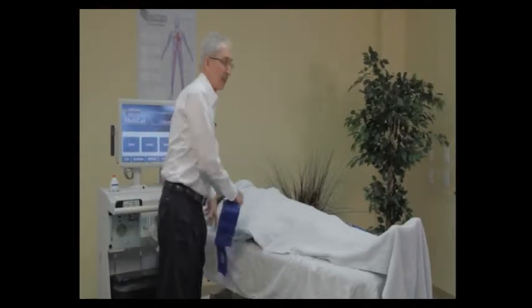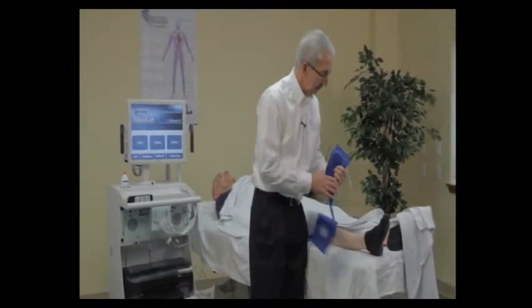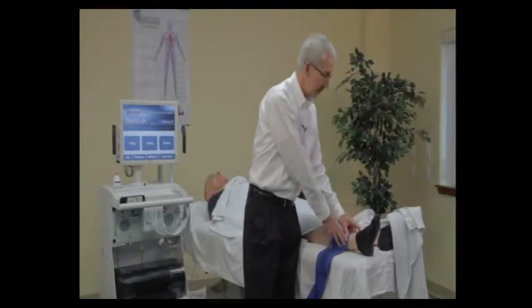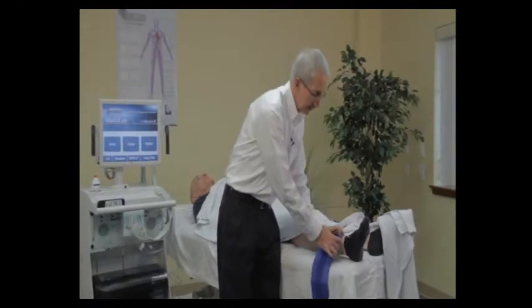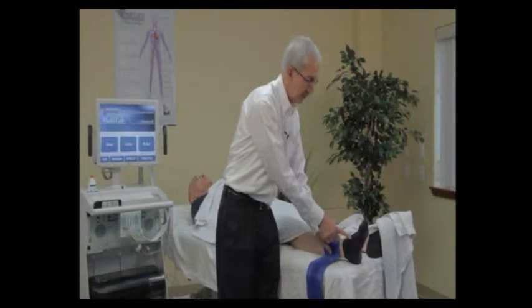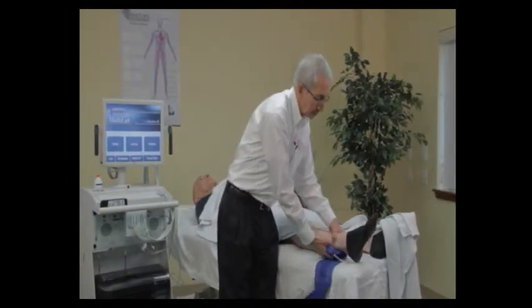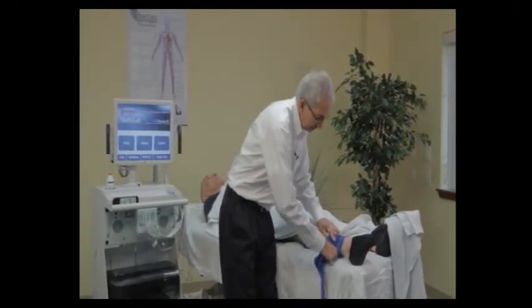Next we move to the ankle site. The ankle cuff is going to be positioned about an inch and a half above the ankle. Sometimes you'll need a little space above the ankle to reach the posterior tibial artery, and again cuff hose inlet placement is very important. If the hose is positioned toward the front it's going to interfere with finding the dorsalis pedis vessel, and if tucked near the medial malleolus you'll be fighting it with your Doppler probe for the posterior tibial. I like to rotate these externally and apply them snugly.